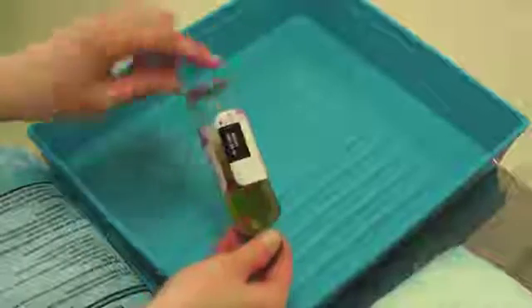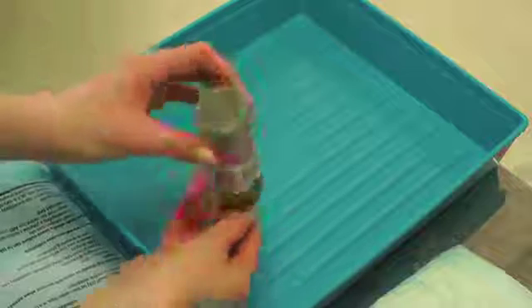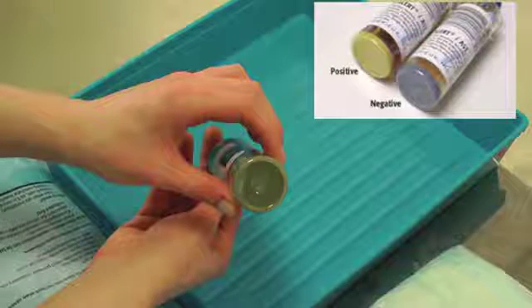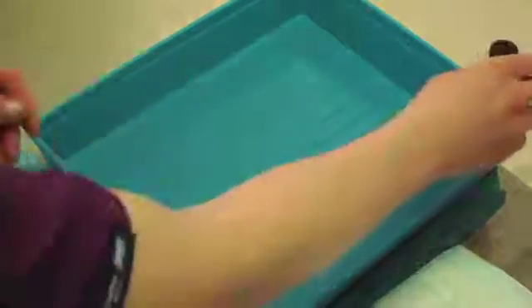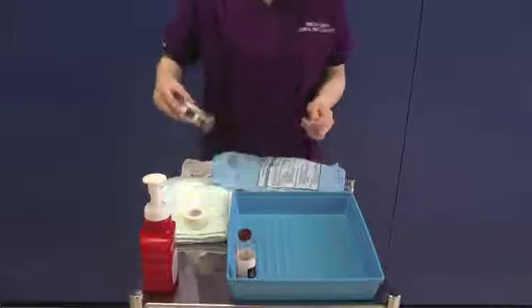Check the expiry date on the blood culture bottles. There is a barcode that must not be removed. Also check for contamination, which is indicated by a yellow discoloration on the bottom of the bottle. There is a milliliter scale on the side of the bottle to help you take the correct amount of blood. Repeat this process for the other bottle.